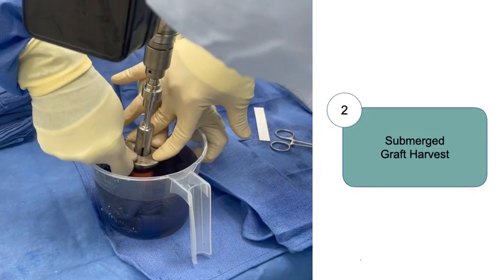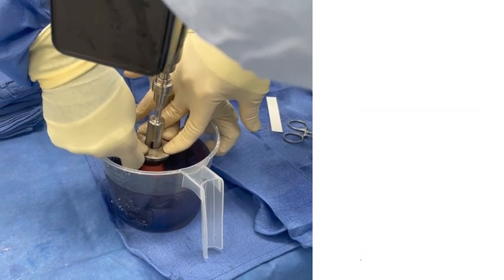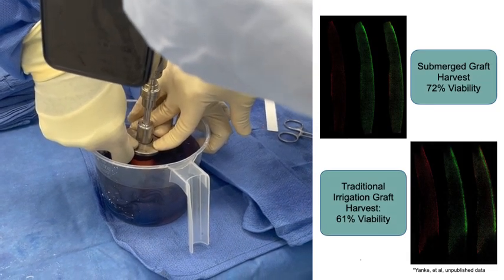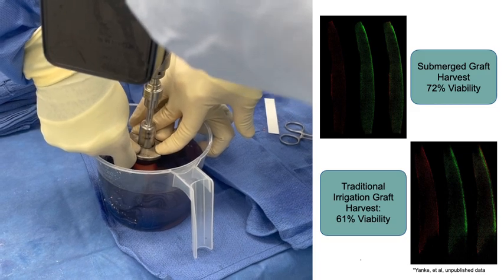We ream our graft while it is submerged in saline to reduce thermal necrosis. Our unpublished cellular analysis demonstrates that submerging the graft during harvest improves cartilage cell viability compared to traditional technique with bulb irrigation.